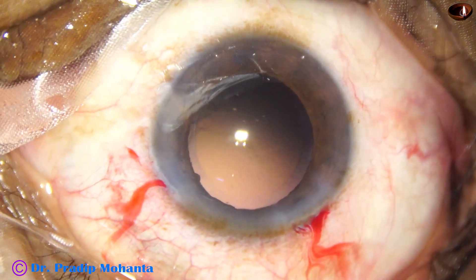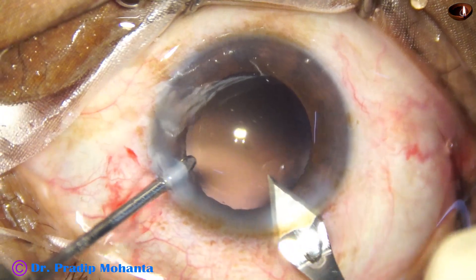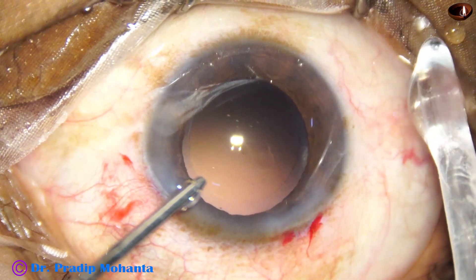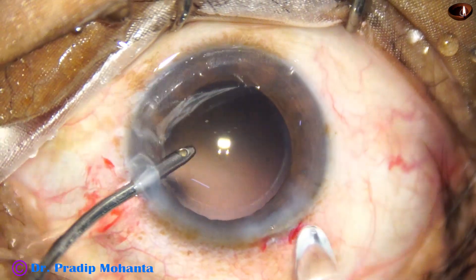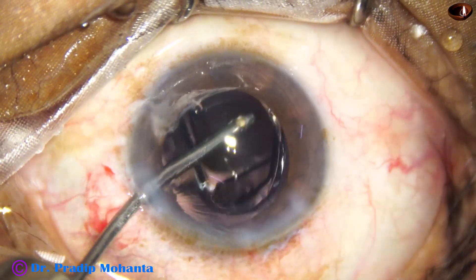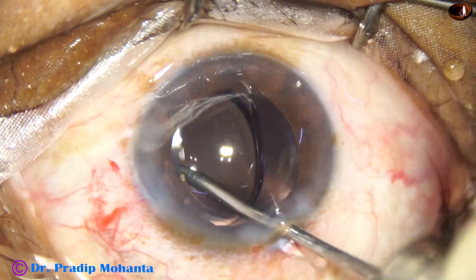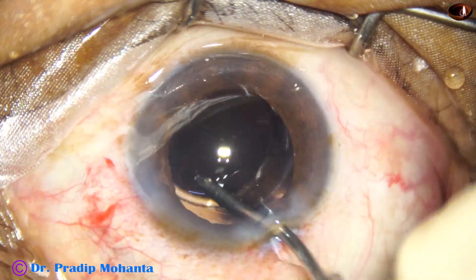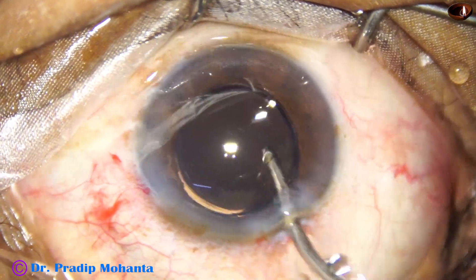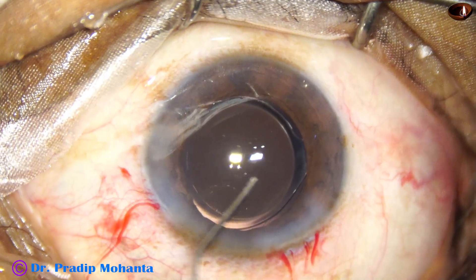The wound is enlarged because I am using a B cartridge — if we do not enlarge it, the tip of the B cartridge does not engage well. Sometimes the intraocular lens is released at the wound and the wound is stressed, requiring us to push or pull the lens very hard to get it into the anterior chamber. The lens has gone into the capsular bag, and this is the dialing of the lens by the irrigating probe itself. Whatever viscoelastic molecules are in the lumen of the cartridge comes out by this irrigation.